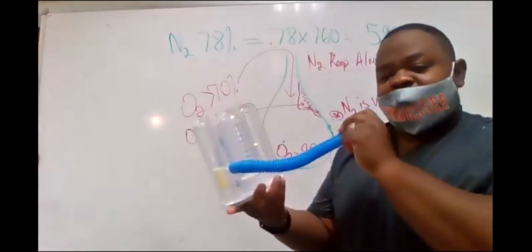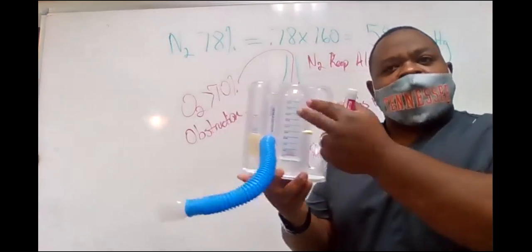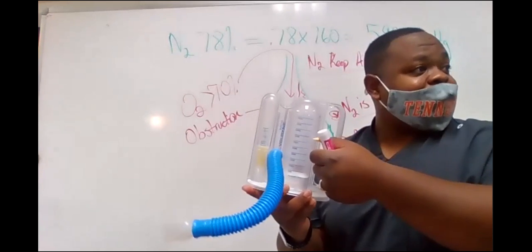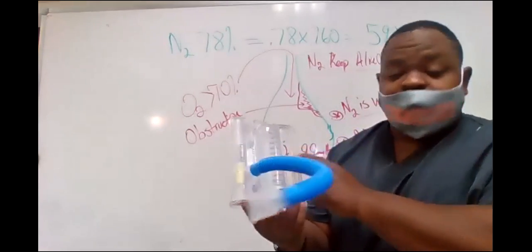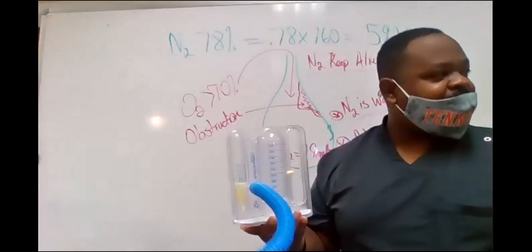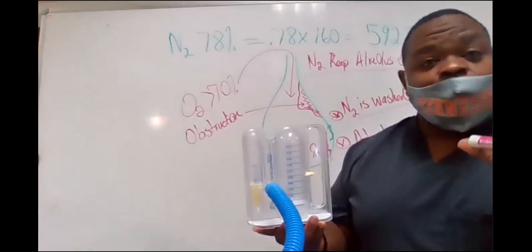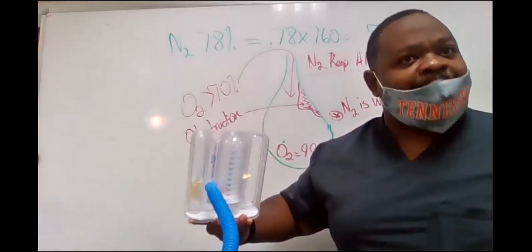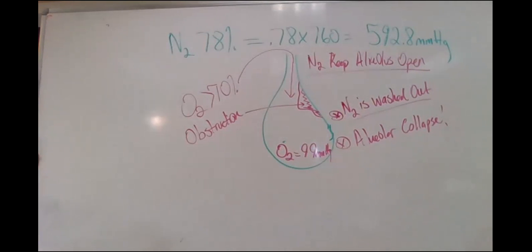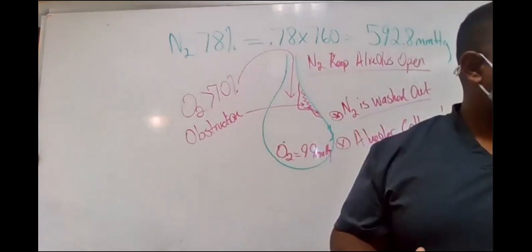Incentive spirometer. What they do is they don't blow in, they inhale and let this bellows go up, and it matches it. You set this to where they should be based on their age, gender, and height. So if they say, Mr. Johnson, you need to be at 2,000, and when he inhales, he's only going to 50, he's got some atelectasis, and he has to keep practicing over a couple of days. He'll eventually get to where he should be, because those deep inhalations will pop those lungs back open, okay? We'll get to this later when we get to J, all right? But that's what atelectasis is, little pockets of closed alveoli, all right?